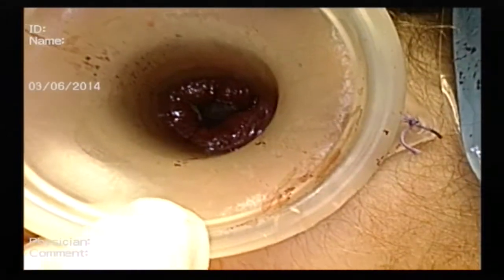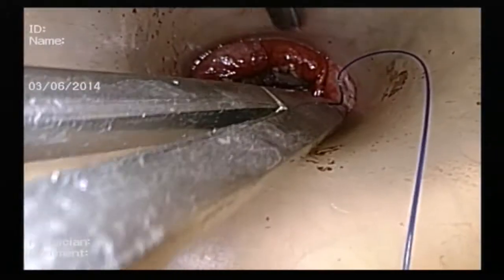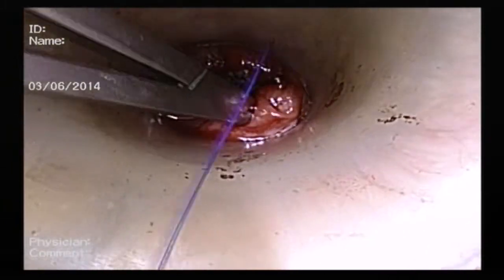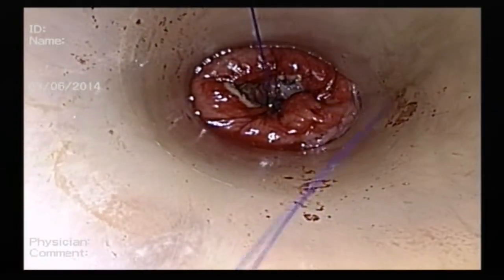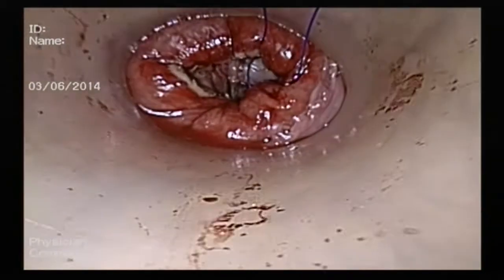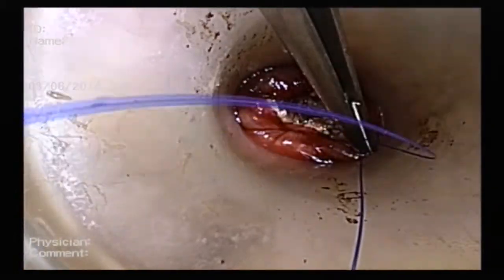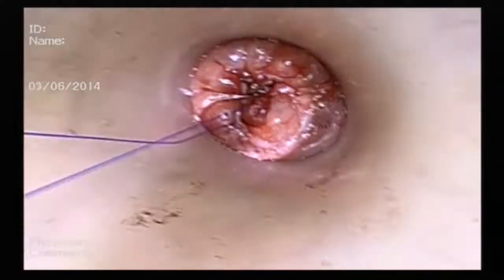The next step is to place a purse-string suture on the distal rectal cuff via the anal port. This suture can be placed either by using standard surgical instruments as shown here, or by using the laparoscopic instruments that were utilised to perform the total mesorectal excision. The purse-string is placed around the circumference of the rectal cuff and the ends are left free and not tied at this stage.